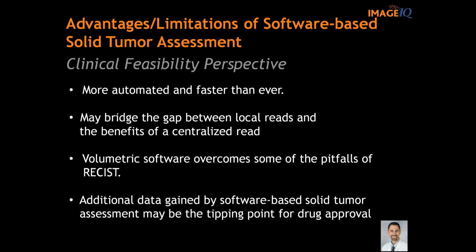You have to validate the software, show that it works, and then once you can show that, the next barrier is time. Is it going to work right on my PACS? Do I have to go off to another workstation? If you can save time and make a whole bunch of measurements, have a nice structured report that pops out, it can be worked into the workflow. But those are some significant challenges to overcome. Okay.